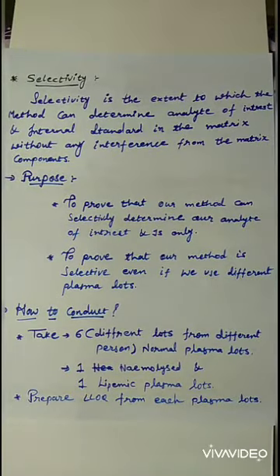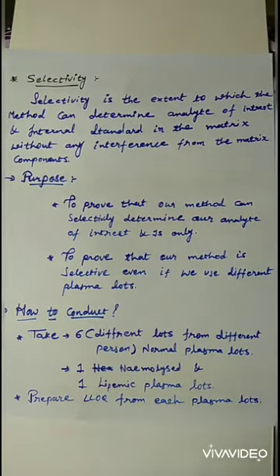As you know, in a BE study, a number of subjects take part. So each of these subjects' plasma samples has different characteristics. So the selectivity experiment is performed to prove that our method is selective even if we use different plasma lots.